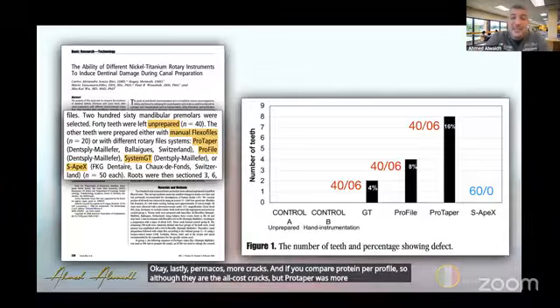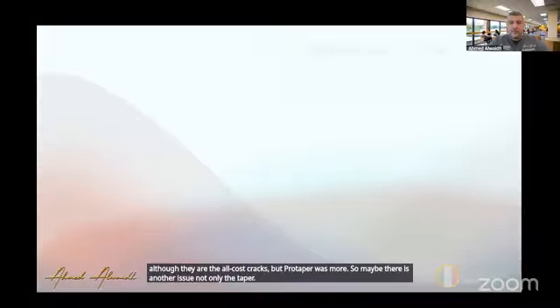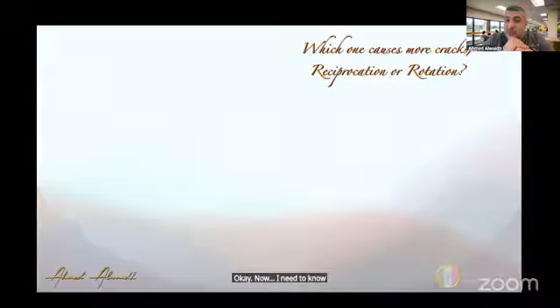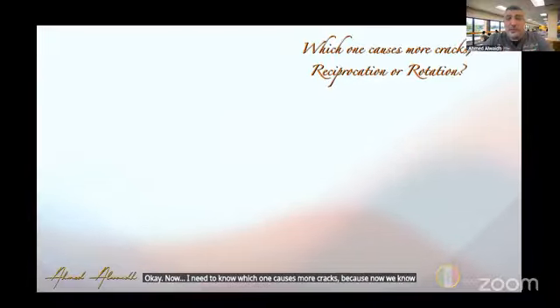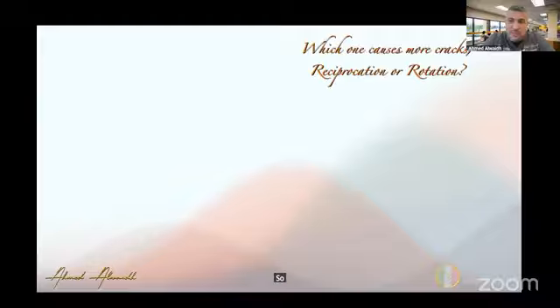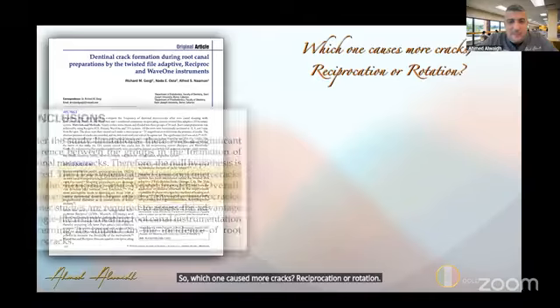So maybe there is another issue, not only the taper. Okay, now I need to know which one causes more cracks, because now we know the rotary files also cause cracks. So which one causes more cracks? Reciprocation or rotation?